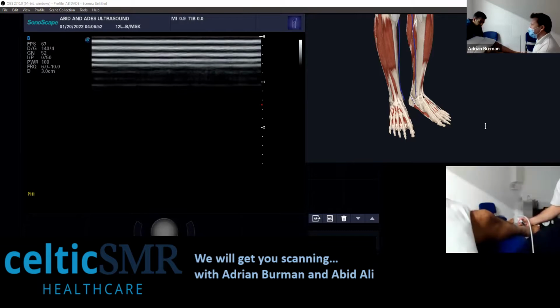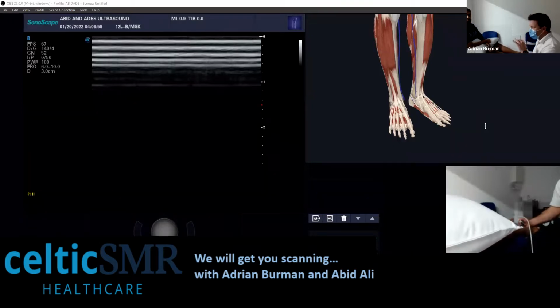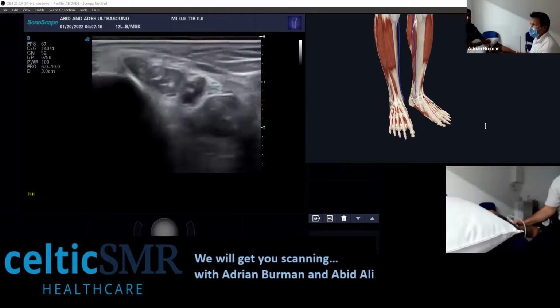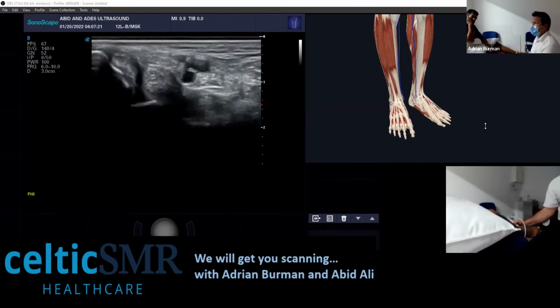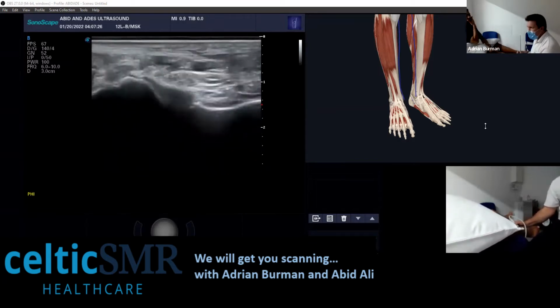Edema as well. Yeah, I think the cobblestoning is just a generic term for the appearance that the edema, or whatever is causing that cobblestoning fluid, is. I think it's just a generic term for the appearance rather than anything in particular. It's basically fluid within the superficial tissues, defining the different sort of globules within the superficial tissues. More an observation, maybe. Yeah.